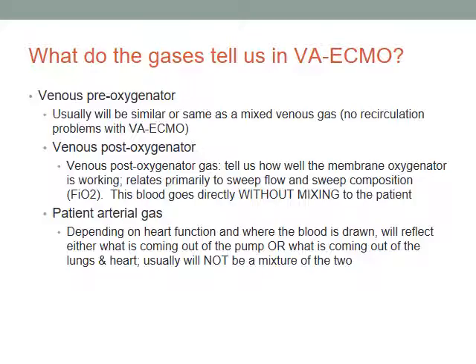And the other thing is, this will change over time. That sick heart may eject at some times and may not eject at other times. So you may see that at various times, you're getting perfusion entirely from the ECMO circuit, and other times you're getting a combination of patient LV pumping coupled with ECMO circuit. That heart may beat for 10 minutes and quit, it may go for 2 hours and then slow down, it may never go, it may go all the time. So it's a dynamic process.